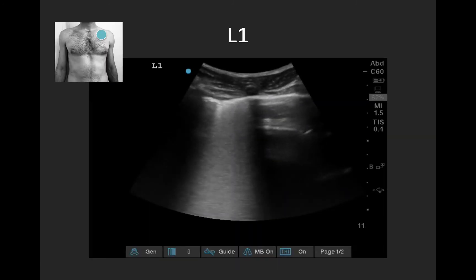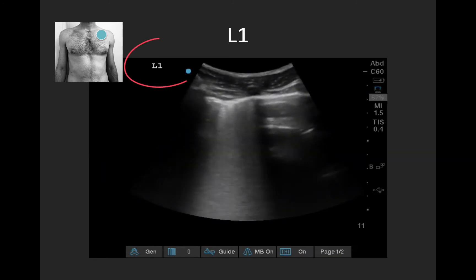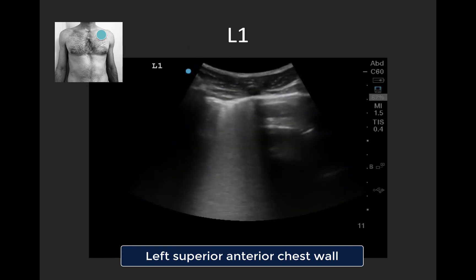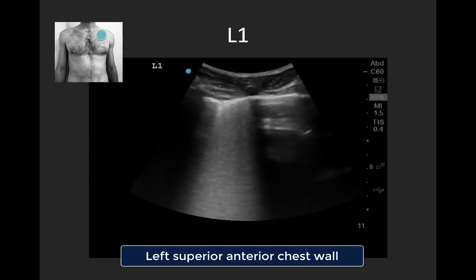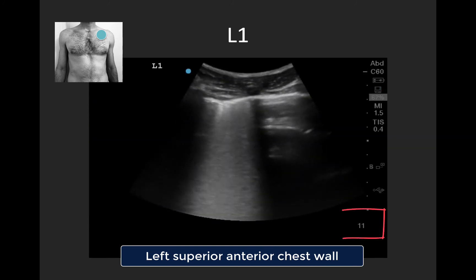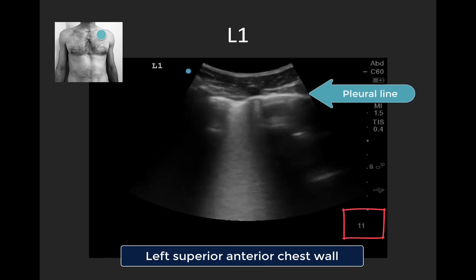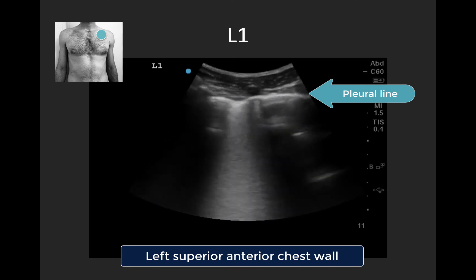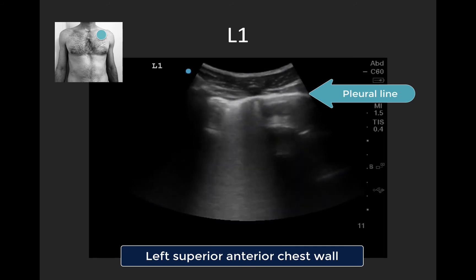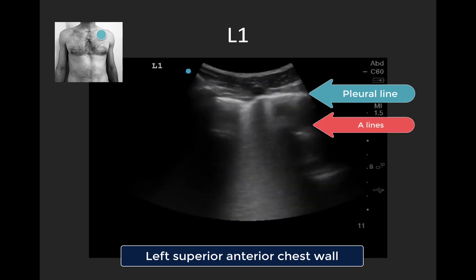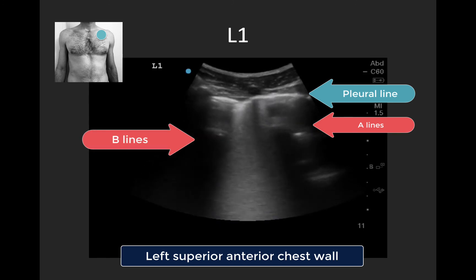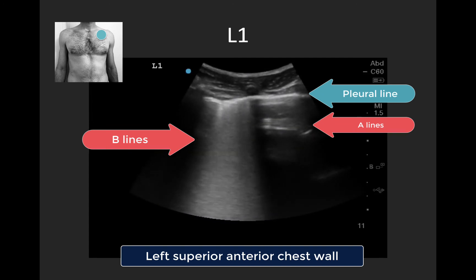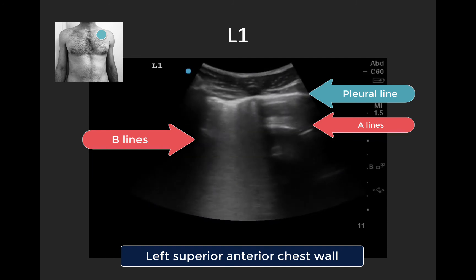Moving over to the left side with the same protocol. This is L1 — the left superior anterior chest wall in the mid-clavicular line at about the second or third interspace, probe in a sagittal plane with the marker pointing toward the patient's head, depth set at 11cm. The nice bright pleural line tells us we're properly perpendicular. Interestingly, in one rib space on screen right we can see A-lines, but the centered rib space is dominated by B-lines with an irregular appearing pleura, which can give us a clue as to the underlying pathology. Stay tuned for a future screencast on the nuances of lung ultrasound for interstitial syndromes.